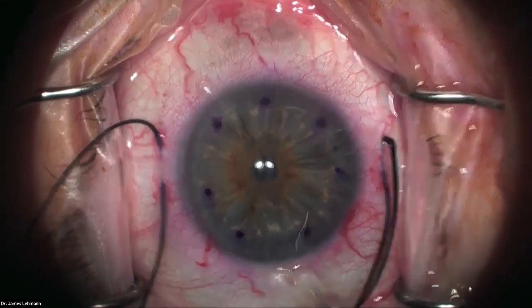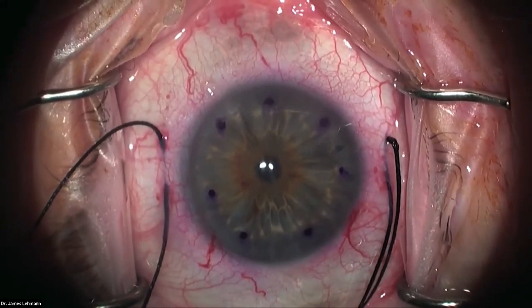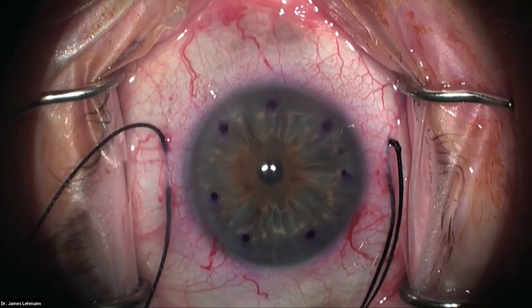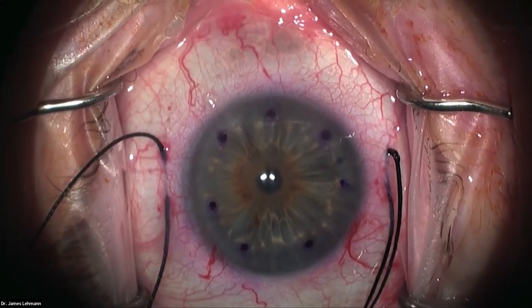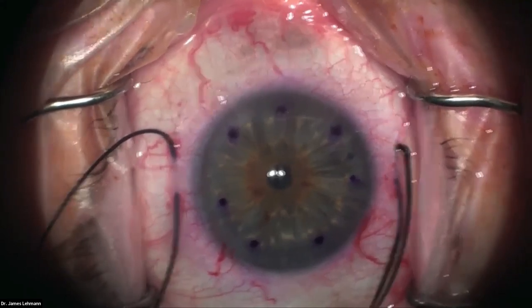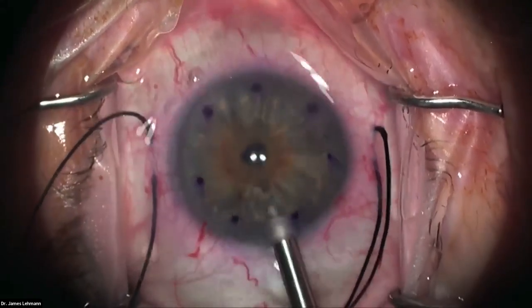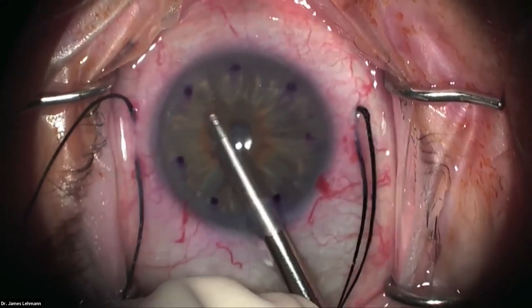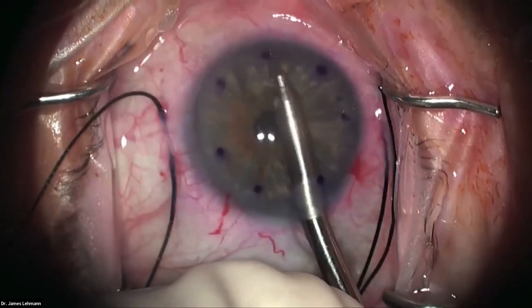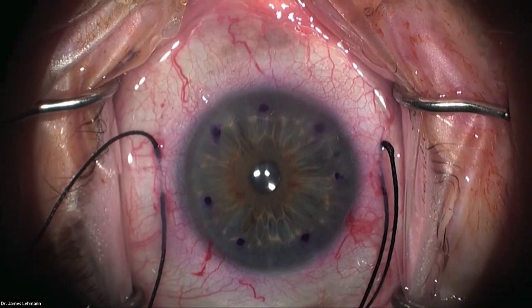Descemet's comes out in one nice big piece — even though it broke in half, I got the whole thing. I hand it to the assistant. Now I remove the viscoelastic using the I/A handpiece from the phaco unit. I'm looking around for any tags that may still be there, as they would be problematic for the new graft adhering. No tags present.